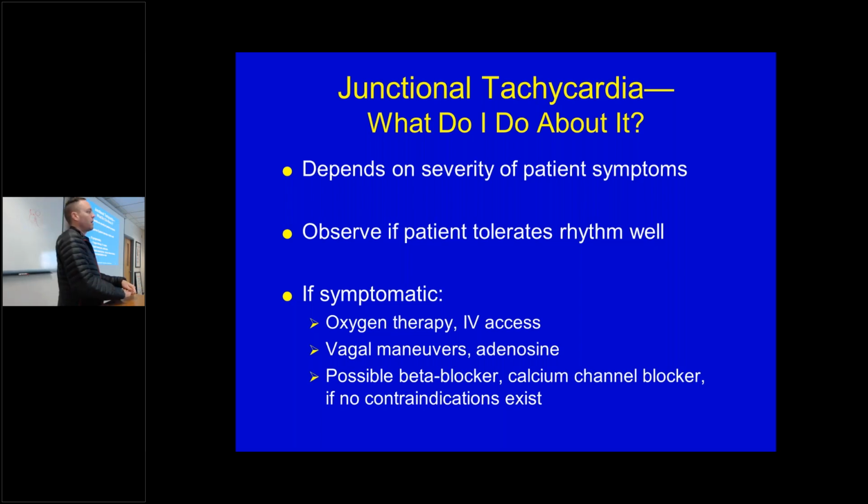So a re-entry. We'd be talking about, and we're not talking about PJCs. You're talking about a junctional rhythm versus even just re-entry tachycardia. I mean, anything that would look similar, because in one, we still have an atria that's working, it's just not working correctly, and we're having the re-entry. And in another one, no PJCs, but the SA node just decided for whatever reason it wasn't going to do its job. And you're wanting to know how you can tell the difference on the morphology. So what happens to the QRS in both of them?